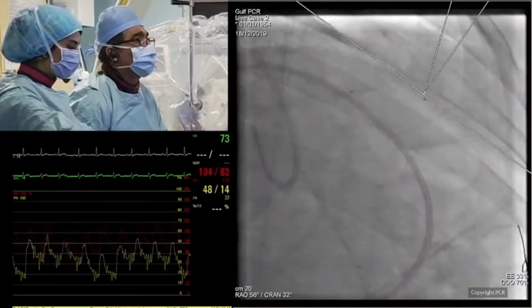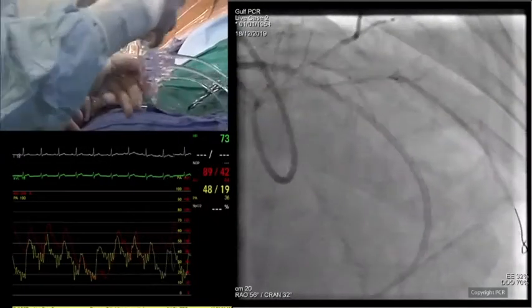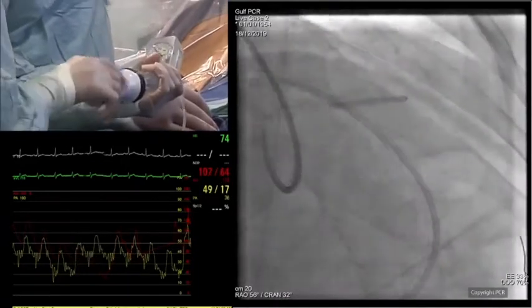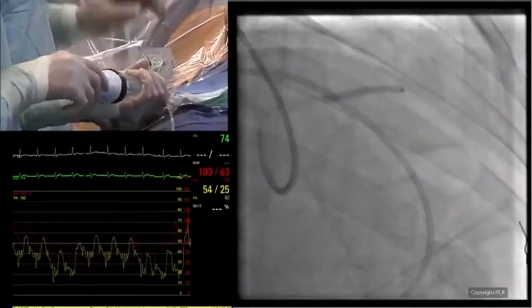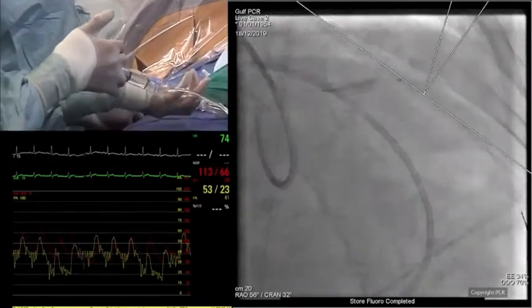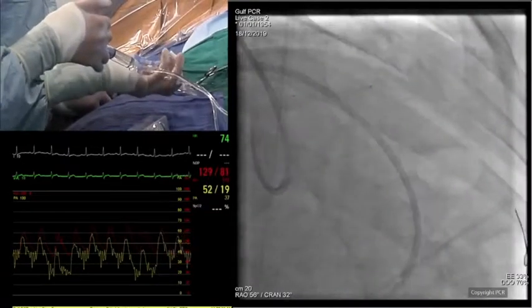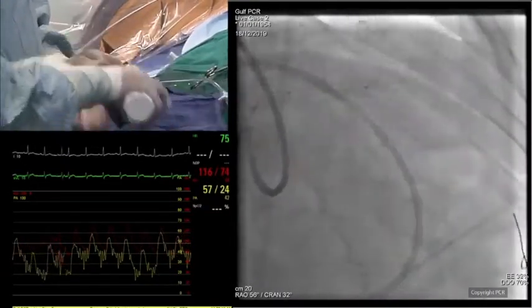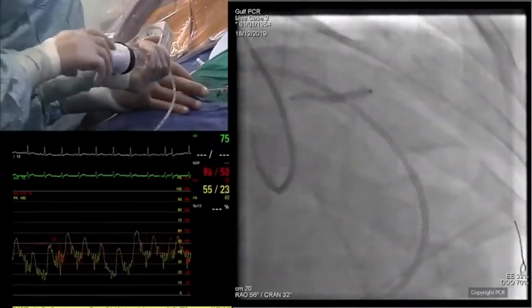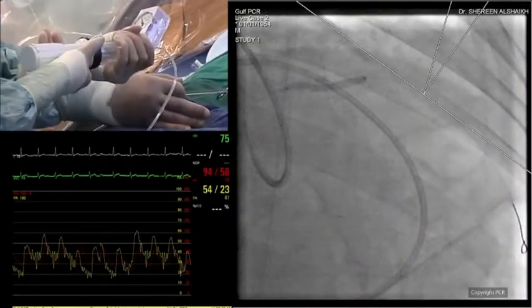Dr. Hussam for the evaluation of the lesion, and also preparing it well before considering the stent, and also to test whether we need a debulking device, either rotational or whatever the debulking. The balloon is opened very nicely, so that's in agreement with what Shireen was talking about in the OCT. Arif, you're an advocate of OCT, especially lately. Would you do the same? We have been doing this for the last 10 years. Lately, more energetic, I mean.